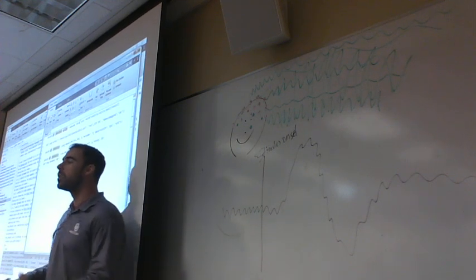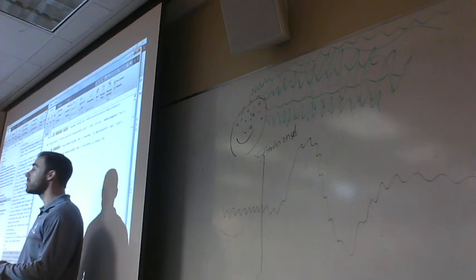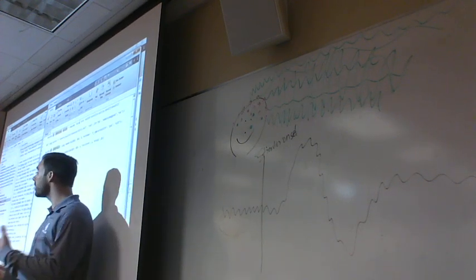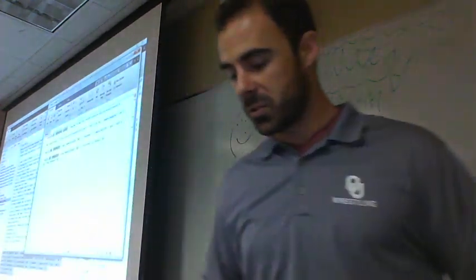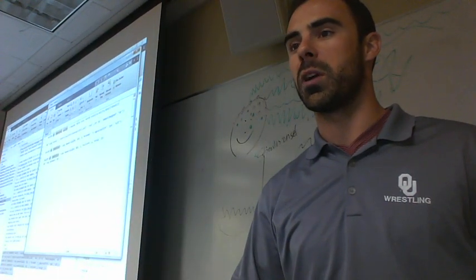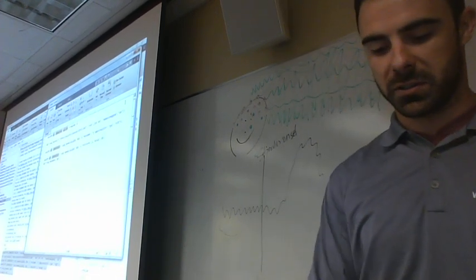So what you can do is, as we go through class in the semester, if you need to take notes on what we're doing, this is one way to do this simultaneously while learning a little bit about the internal code, if you're so interested. So what I like to do is use this, instead of writing blah, blah, blah, I write up myself a little bit of a note about what this is.